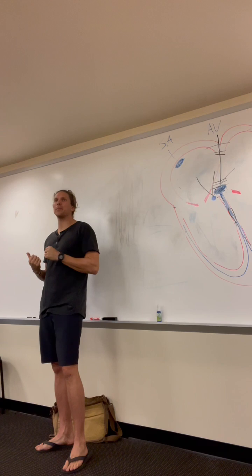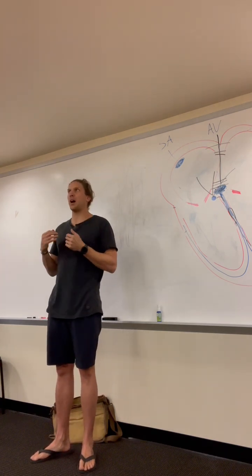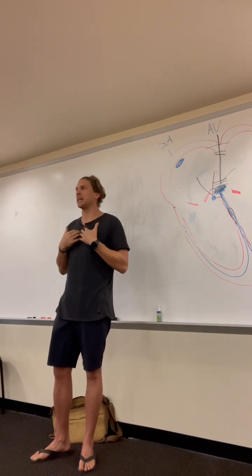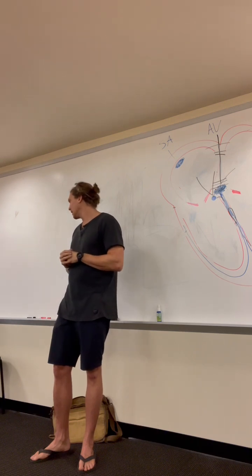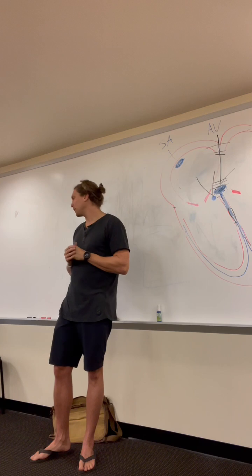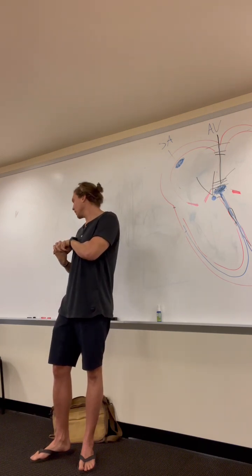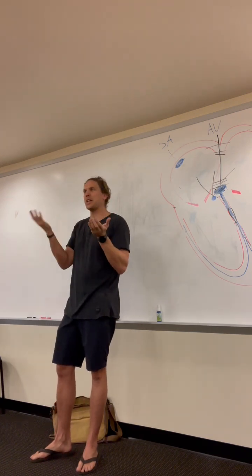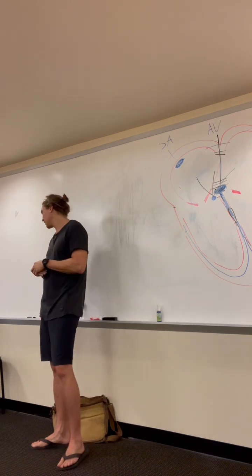This kind of happens when you breathe. It's called sinus arrhythmia. Take a deep breath, let it out. Your heart pauses and then it beats. It has to do with blood filling in your heart. When you breathe, the negative pressure pulls more blood in. It happens when you breathe. So in her slide, she says it happens when you sleep as well. So don't get this one confused. What helps you identify this one, you can memorize the way it looks for the test, but there's no P to QRS mismatch. There's a P for every QRS and QRS for every P.